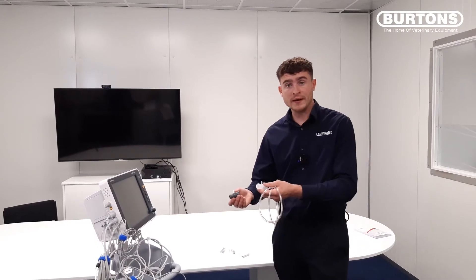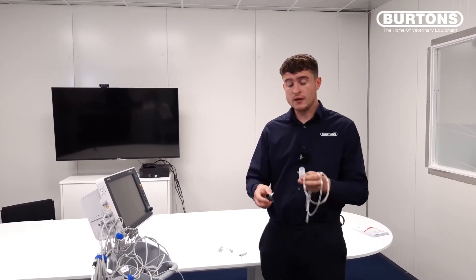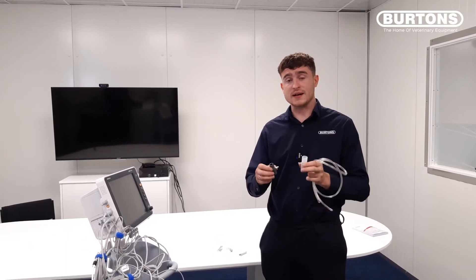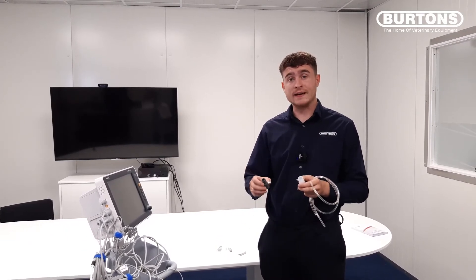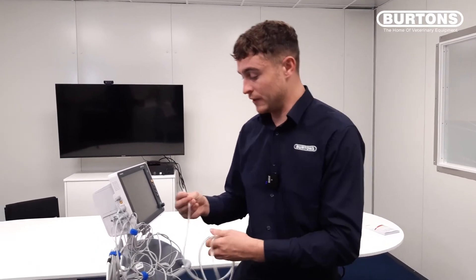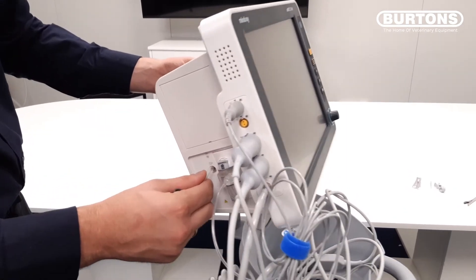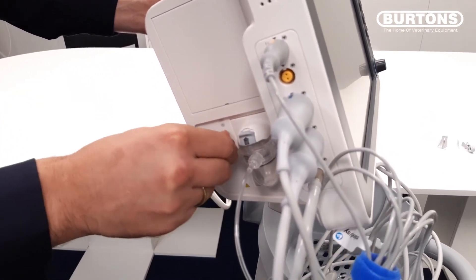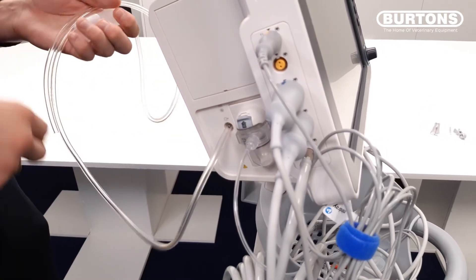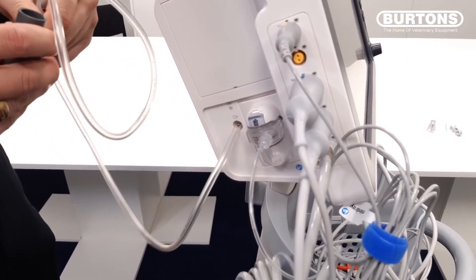Also available for the UMEC is a scavenging kit that comes with two connectors to allow you to connect to a waste gas canister or an inline active scavenging system. To connect this to the monitor, we simply push on like so, and we attach the other end of the hose to the connector.